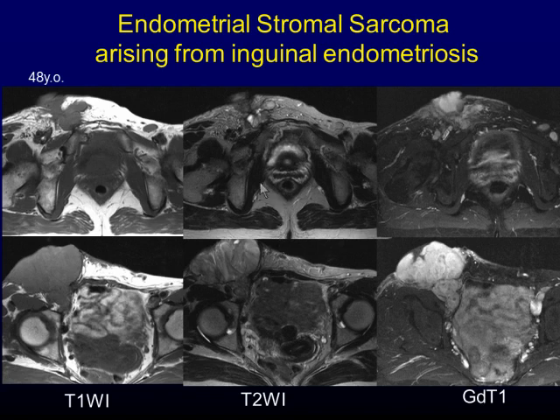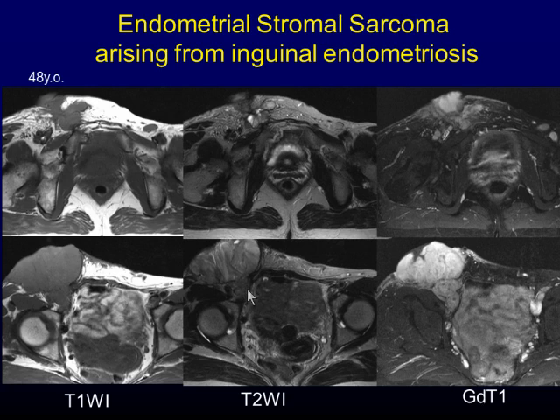This is a case of malignancy arising from inguinal endometriosis. Although rare, endometrial stromal sarcoma is also derived from endometriosis. This patient was diagnosed with right inguinal endometriosis four years before this image was obtained. After that, a right inguinal protrusion was noticed and proved to be endometrial stromal sarcoma from endometriosis by several biopsies. Vascular invasion to the right inguinal vessels is characteristic of endometrial stromal sarcoma.